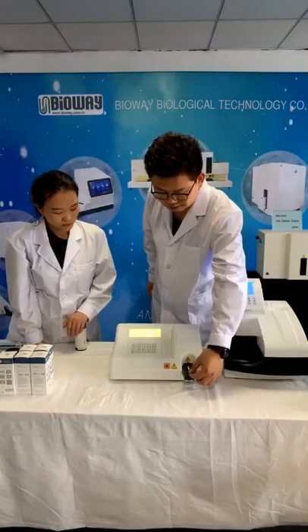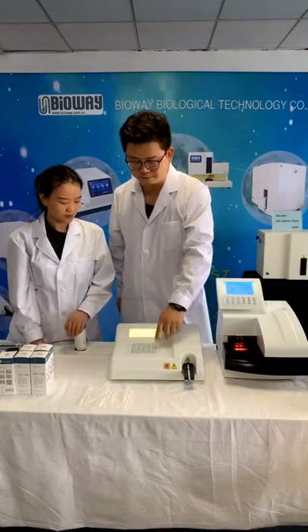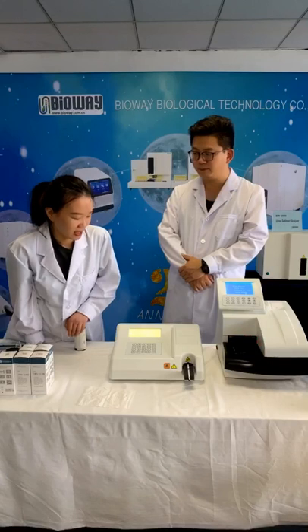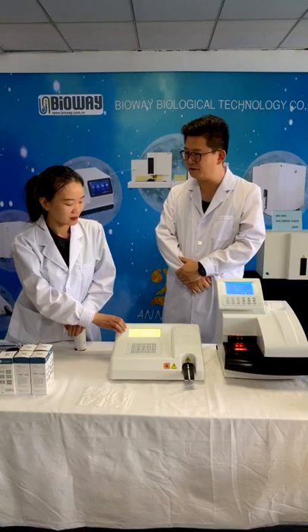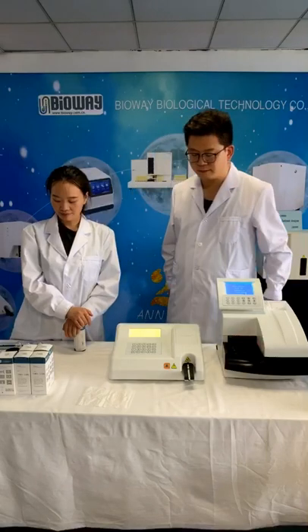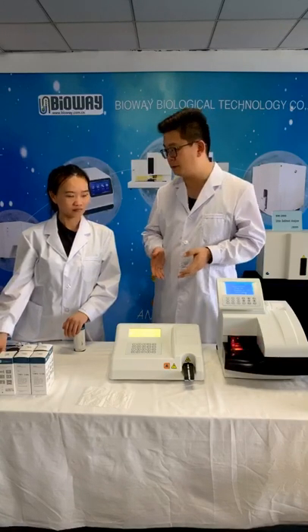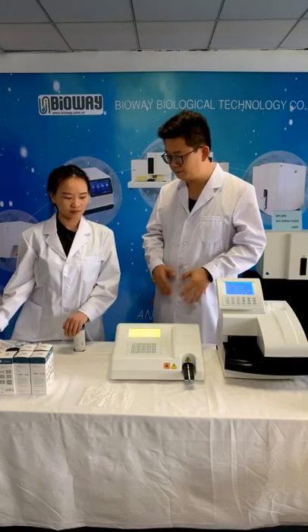So we put the strip into the slot and press start. It's going to take some time to wait, approximately 25 seconds. This time we are waiting just for the chemical reaction between the urine strips and the urine samples. This is a regular test.